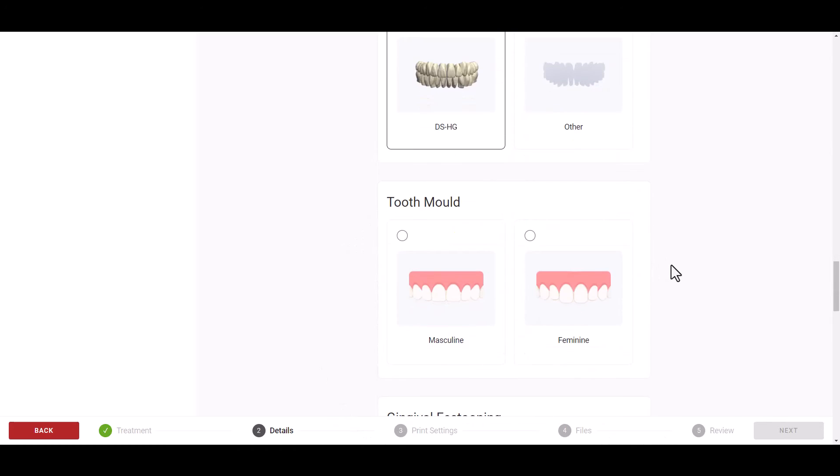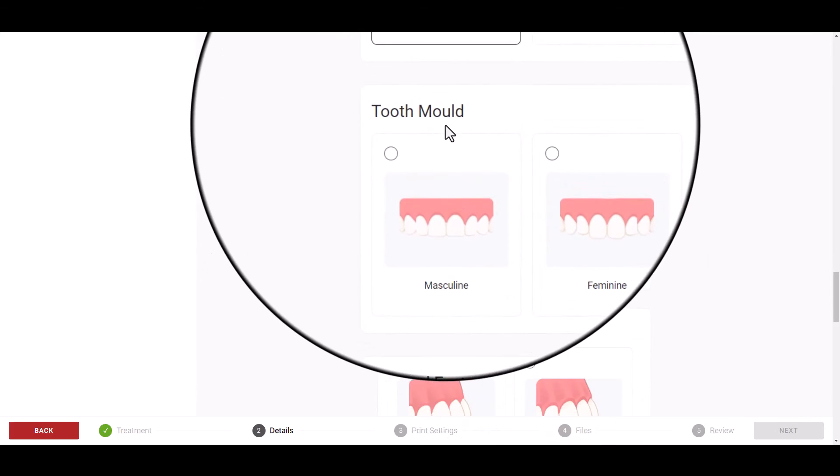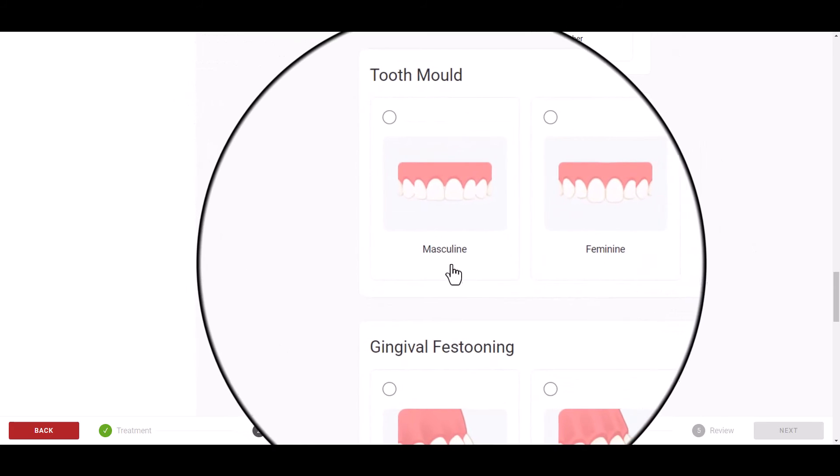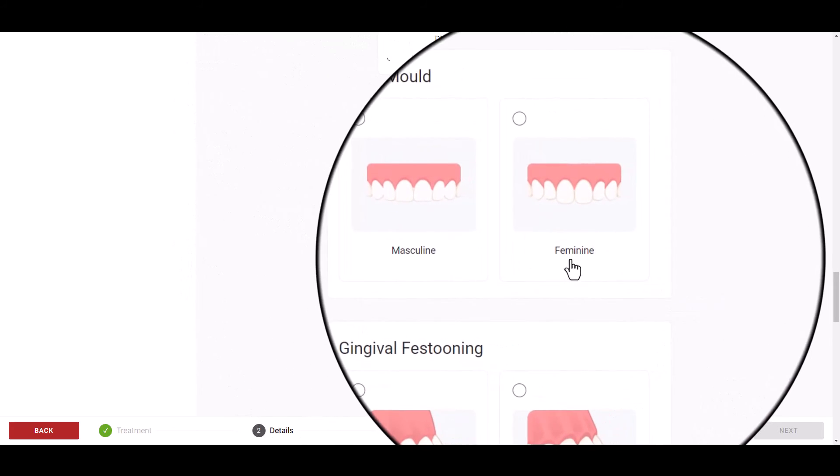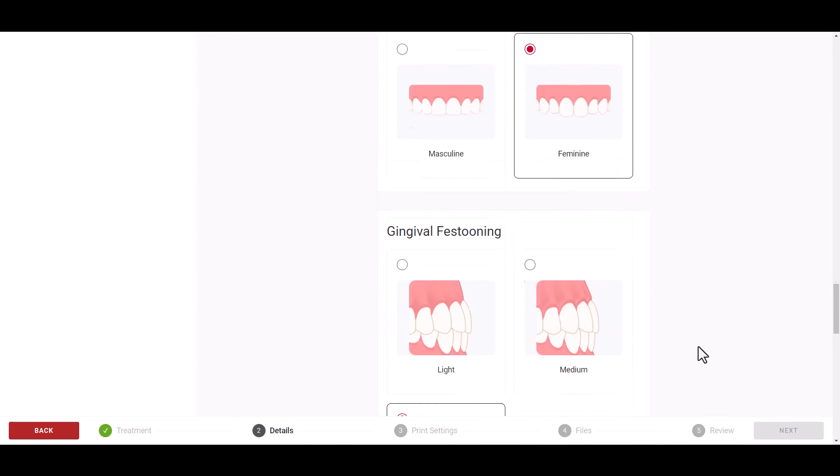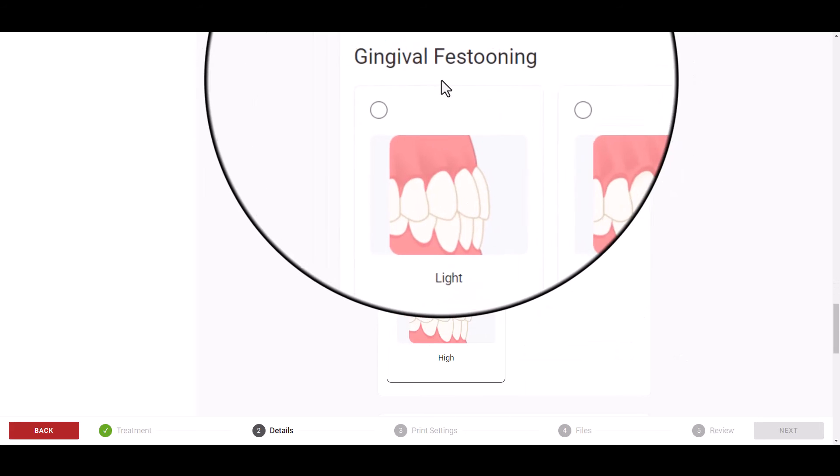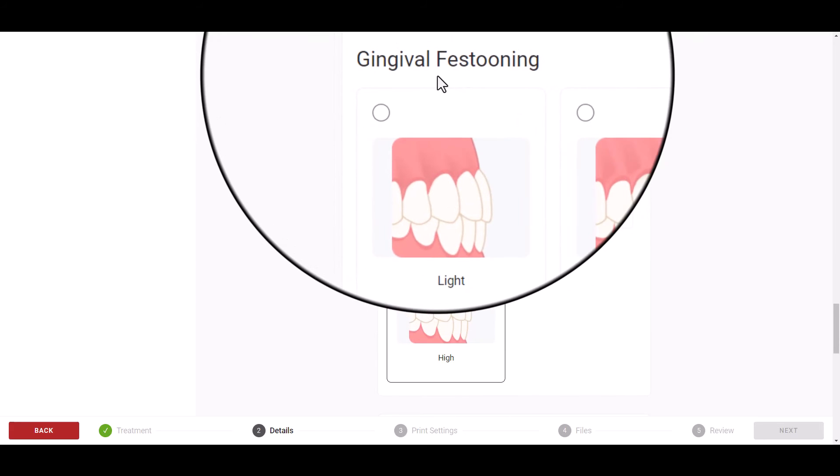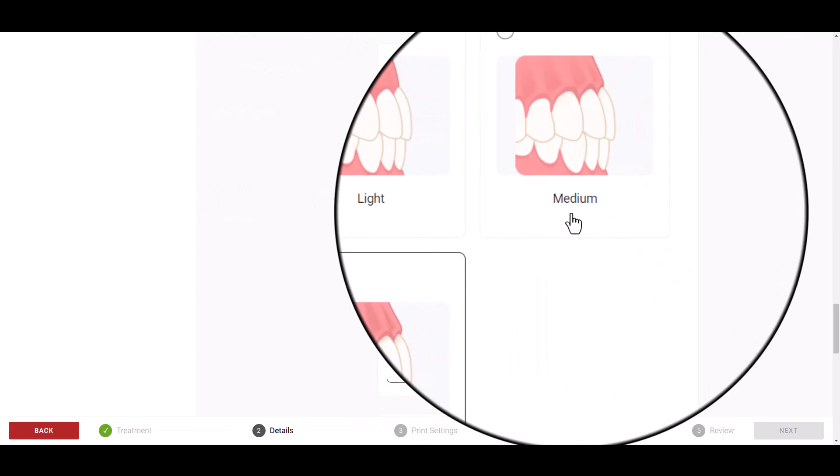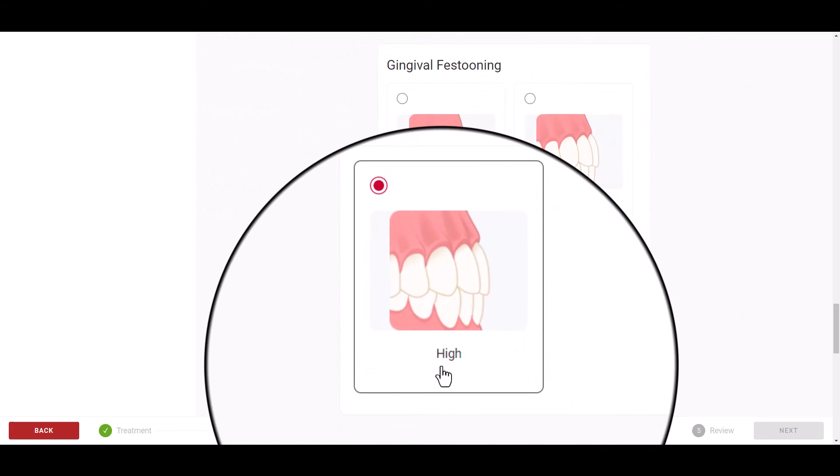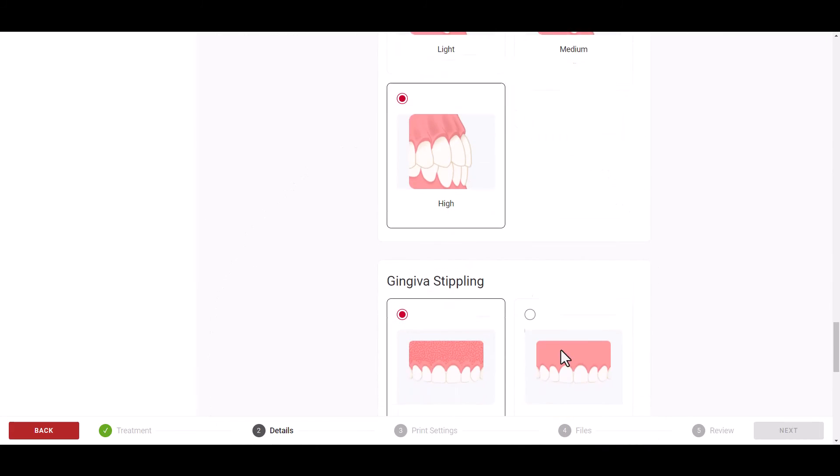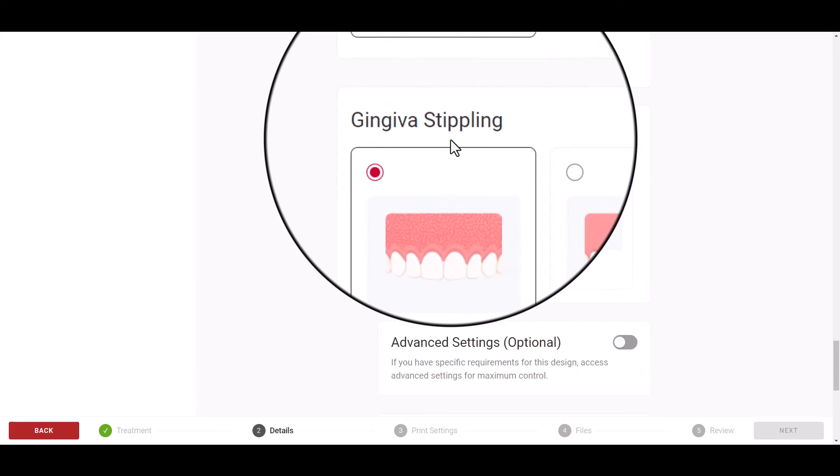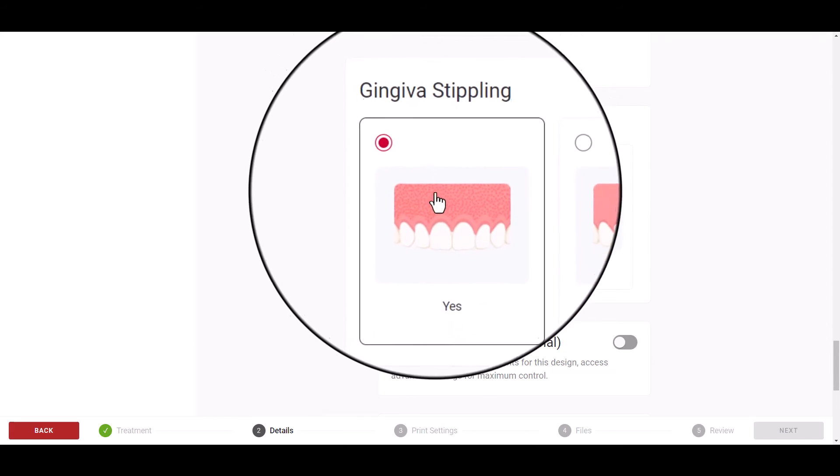You will also have the ability to choose the tooth mold and specify masculine or feminine. And for gingival festooning, you will have the ability to select between light, medium, or high. The Pro Denture Design also offers the option for gingival stippling.